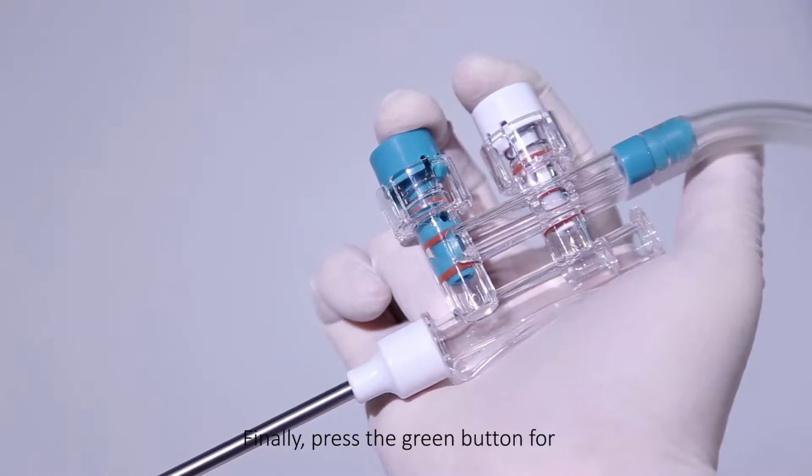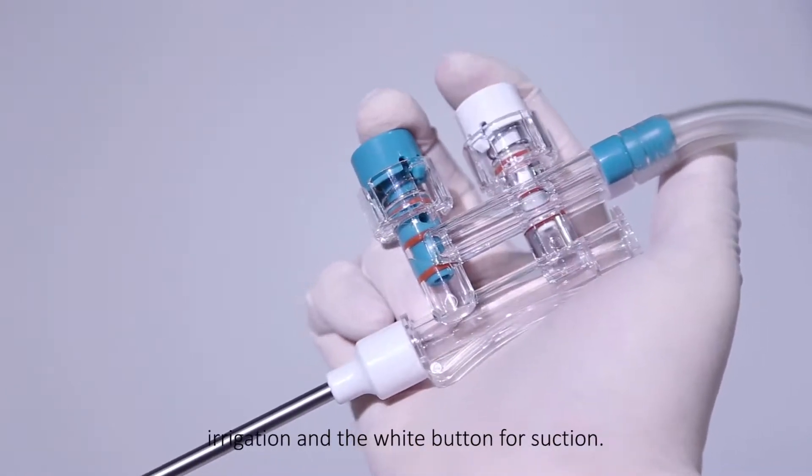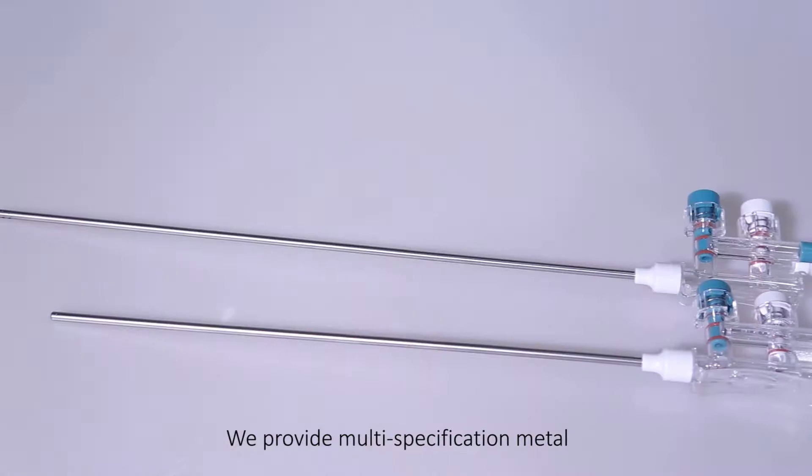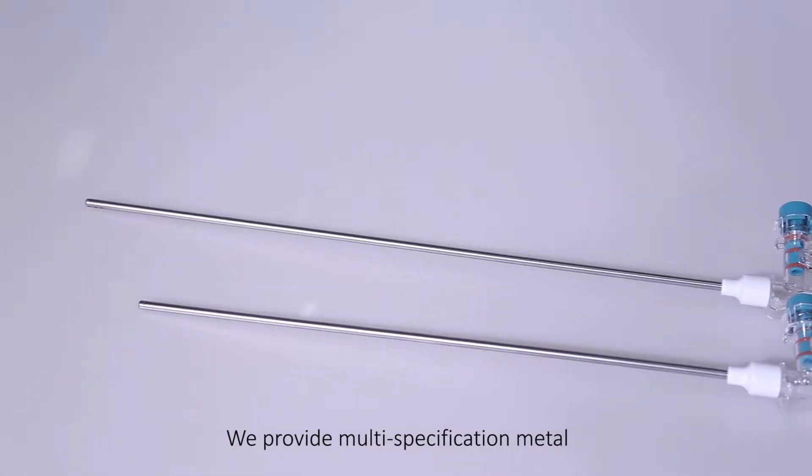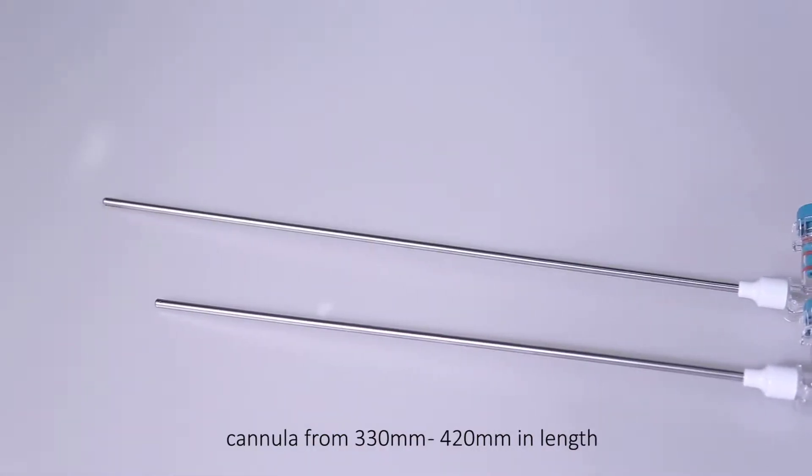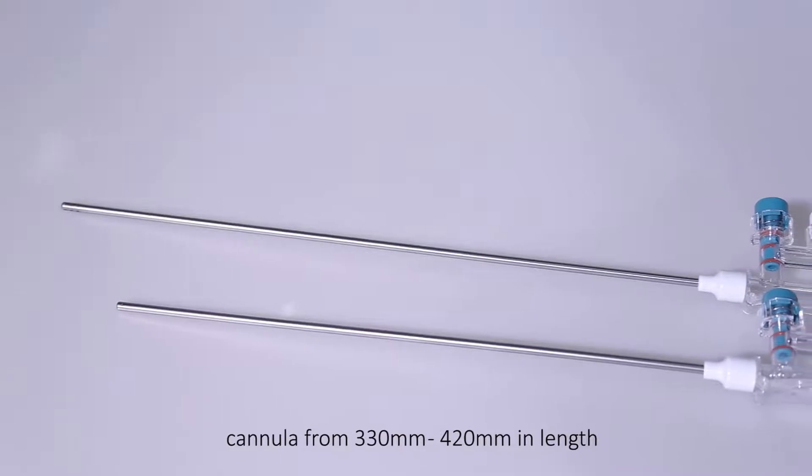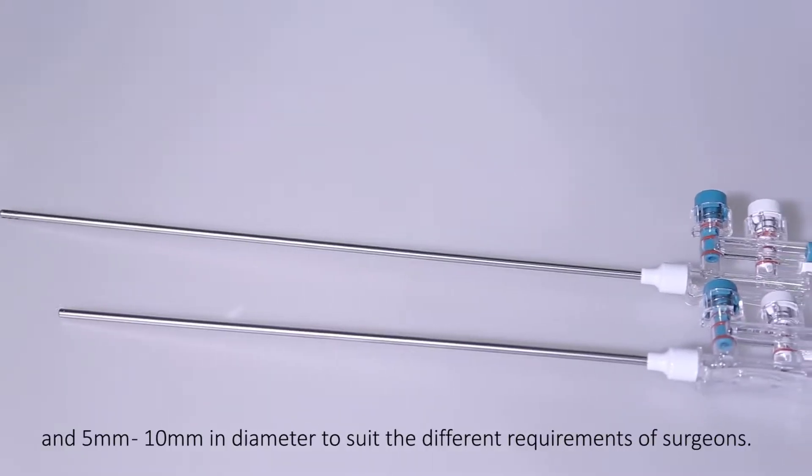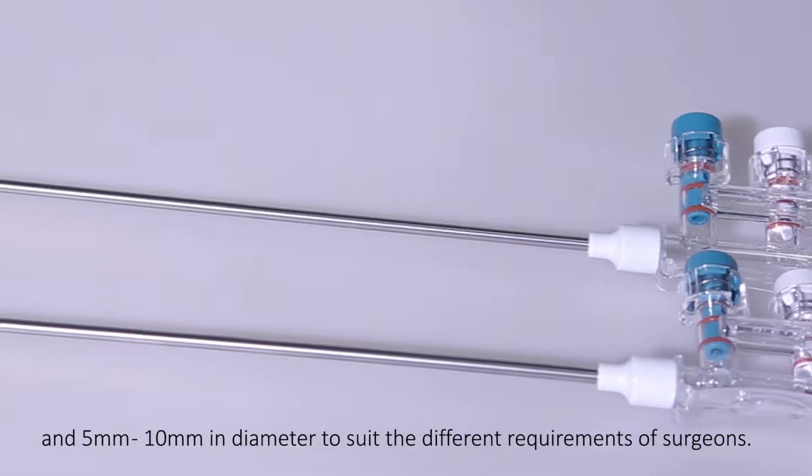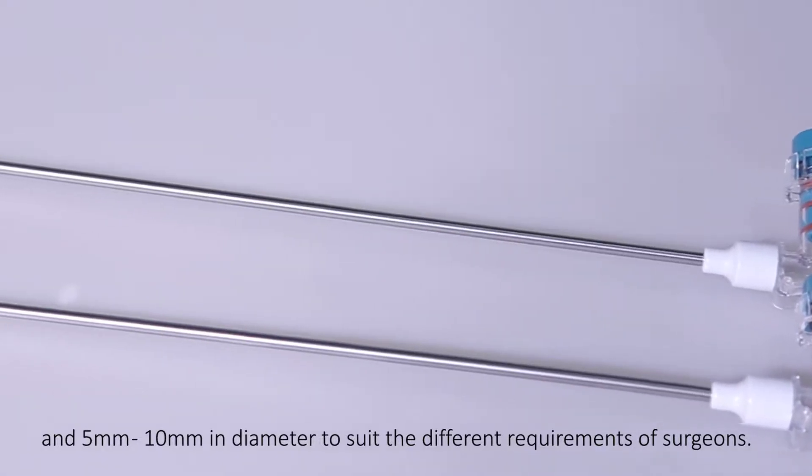Finally, press the green button for irrigation and the white button for suction. We provide multi-specification metal cannula from 330 mm to 420 mm in length and 5 mm to 10 mm in diameter to suit the different requirements of surgeons.